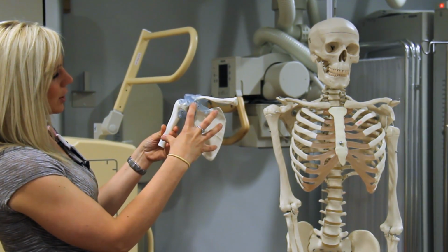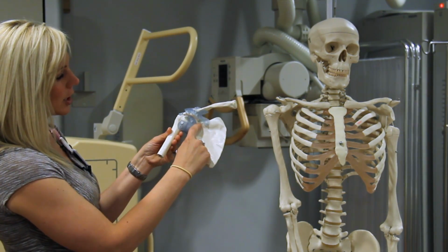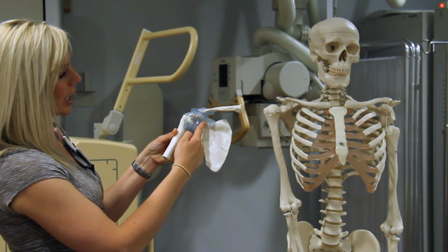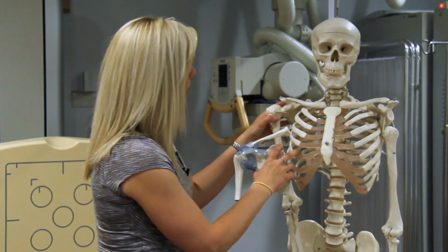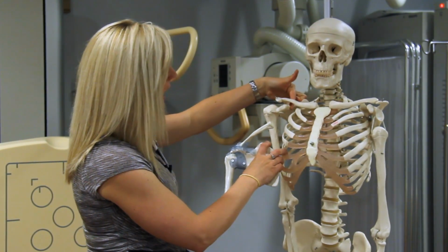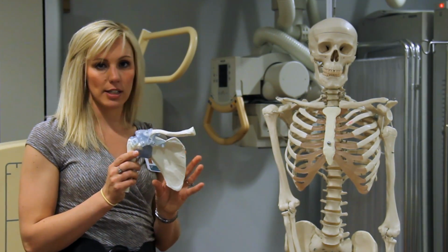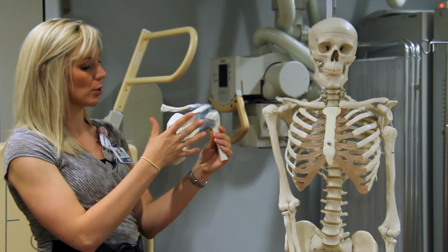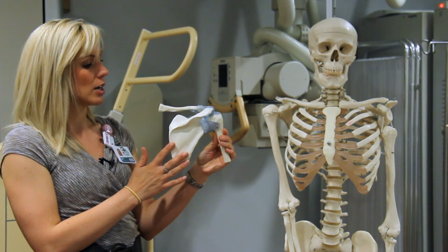Also on the anterior view, on an AP, we would see what we call the scapular notch, a little indent between the superior border and where the coracoid projects out, tucked in right behind the coracoid. Our second surface is the dorsal surface. Looking at the shoulder from the posterior view, the dorsal surface is the whole back aspect of the scapula.